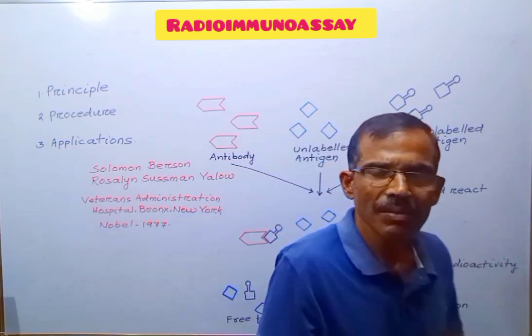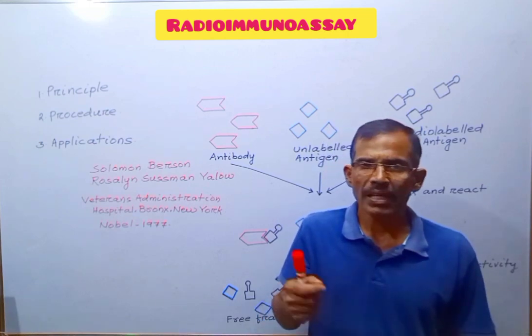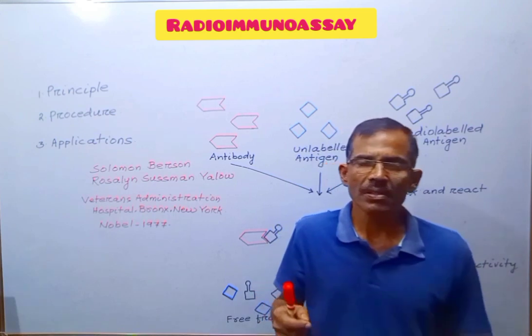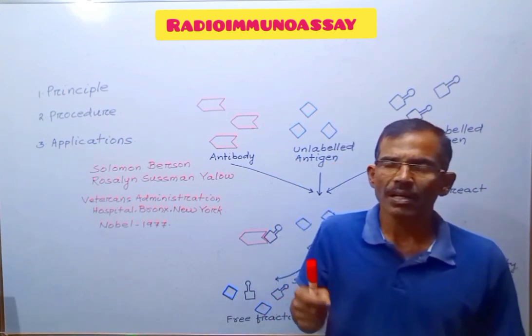Radioimmunoassay is extremely sensitive and specific. It is also least expensive, but it requires special precautions and licensing since radioactive substances are used.